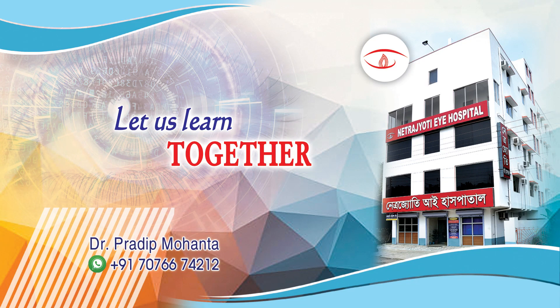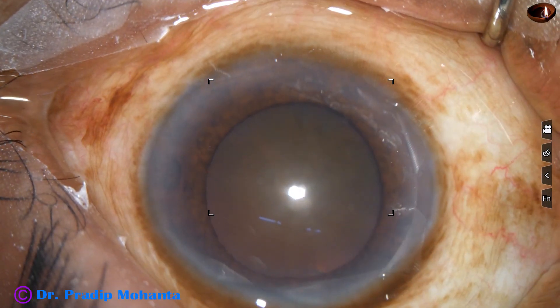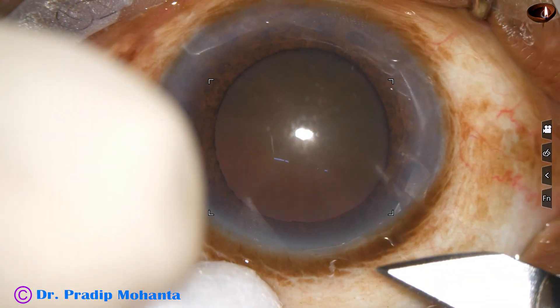Friends, welcome to my workplace for hands-on phaco and SICS training. This is a cataract with grade 5 nuclear sclerosis. The patient is under topical anesthesia. Let us observe this surgery.